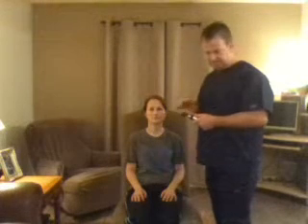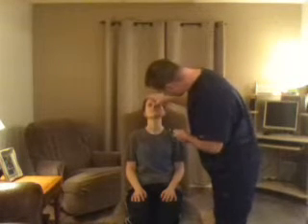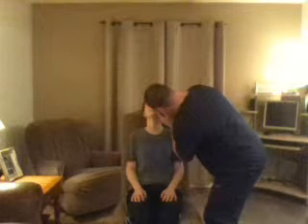I changed my otoscope out here, and I'm going to place my thumb and have the patient lean their head back for me. Good. Pull up gently, starting externally, and we're going to enter into the edge of the nose, viewing the mucosa, the turbinates, also checking the septum for deviation and or drainage or infective looking process or abnormal drainage for that part.